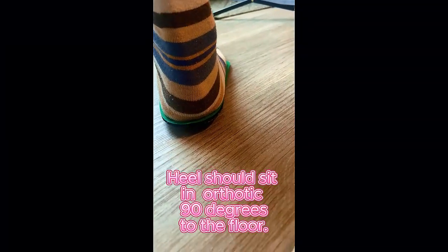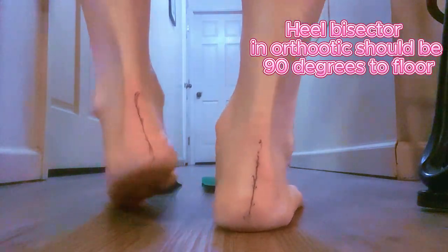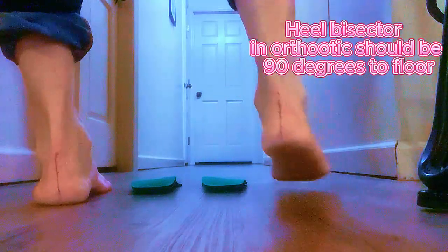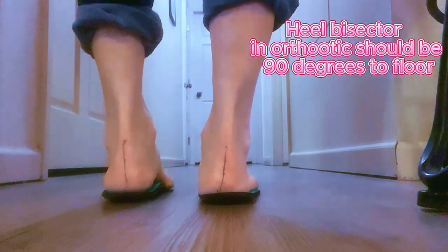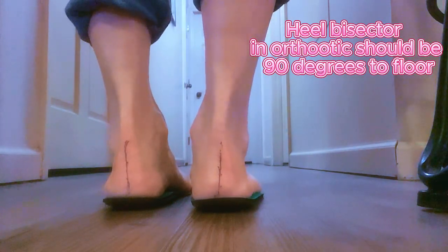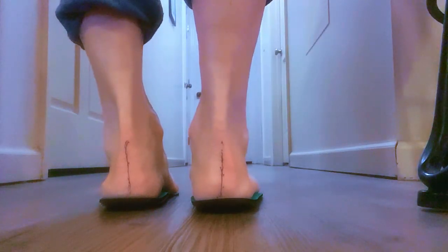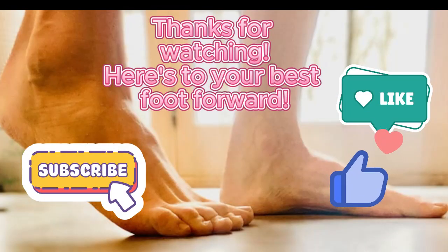Your heel needs to be 90 degrees to the floor in the device. Here are the heel bisectors on my heels. I'm going to step into my orthotic — this is another way to make sure you did it right. The heel bisector needs to be 90 degrees to the floor. My left heel is a little bit skewed — I do have a turned-out heel — but you can wedge that to make it straight.